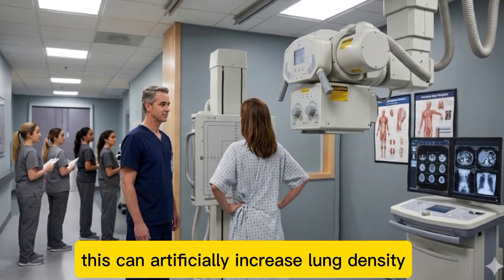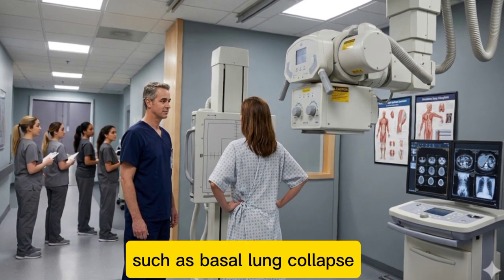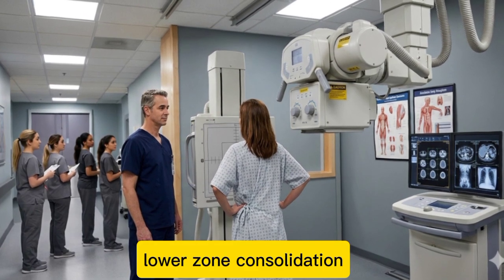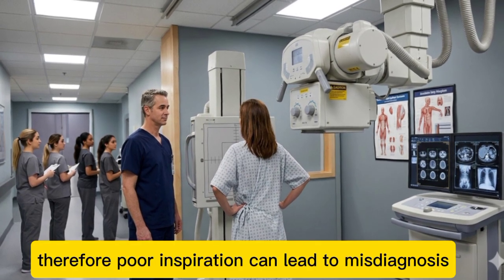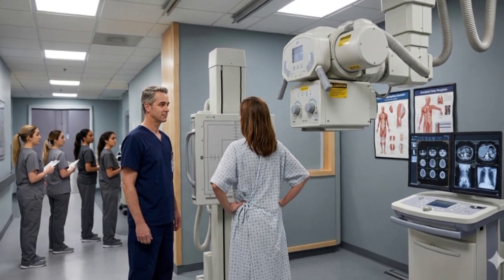This can artificially increase lung density and may mimic pathological conditions such as basal lung collapse, lower zone consolidation, cardiomegaly exaggeration due to crowding of structures. Therefore, poor inspiration can lead to misdiagnosis if not properly assessed.